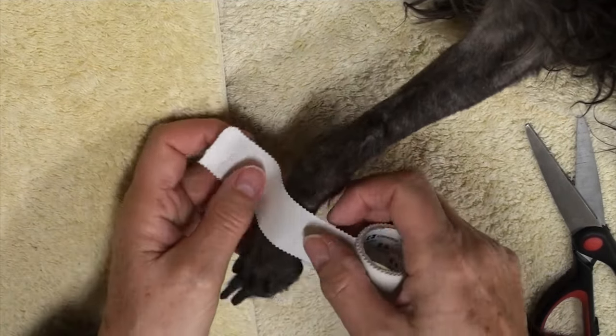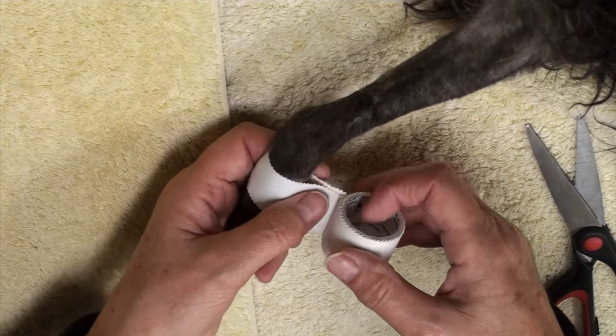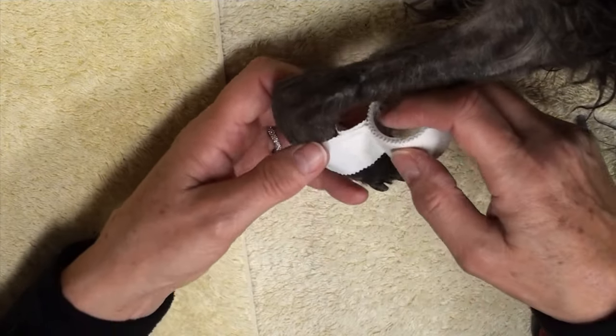In this video we're going to look at two different ways to apply a carpal flexion bandage. The first is on this little dog.